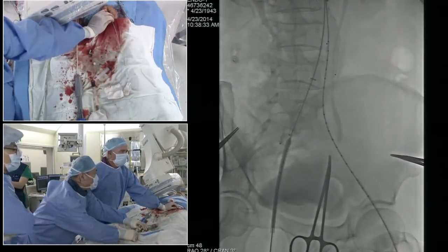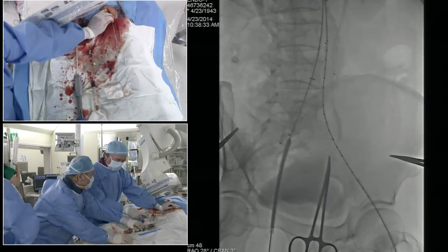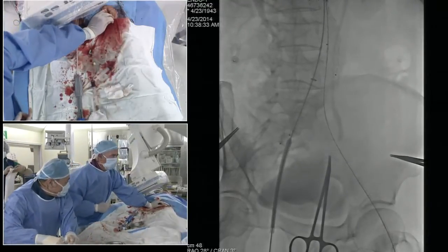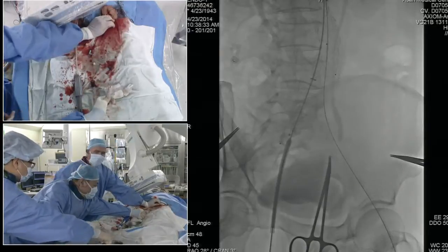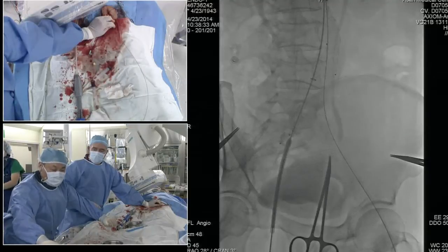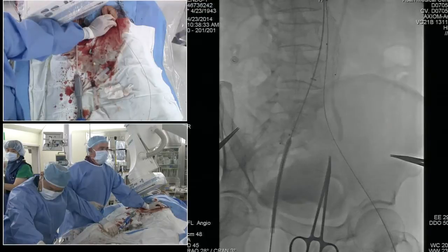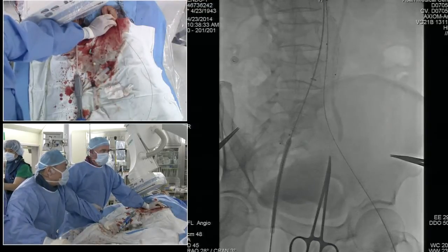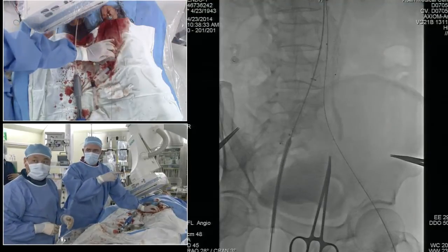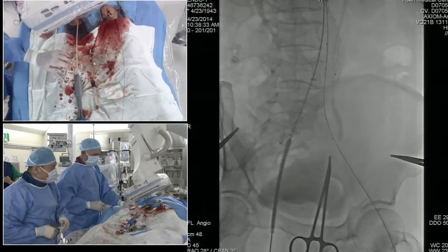So everybody follow that, Rich? So we're basically using the marker pigtail from the top of the landing zone to the internal iliac to pick the length graft. And now, can I have a roadmap from the previous run? John did a great presentation yesterday talking about the importance of the preoperative CT. It really dictates most of what we do. The last run, can we do a roadmap from? Okay. But this is imperative to know this diameter and this length.